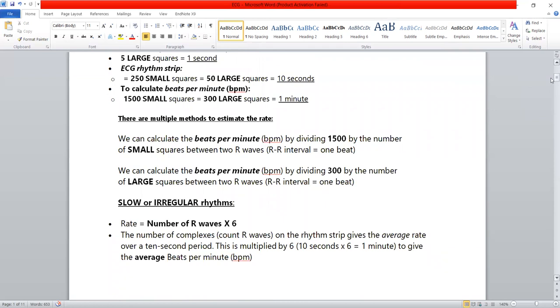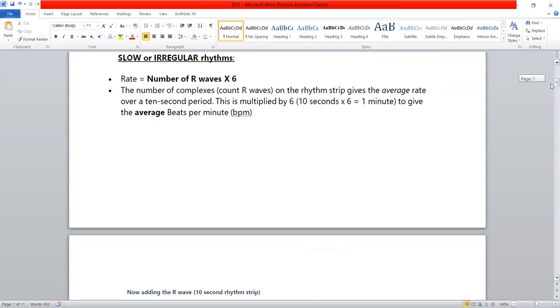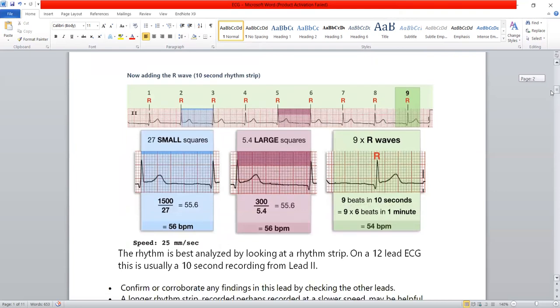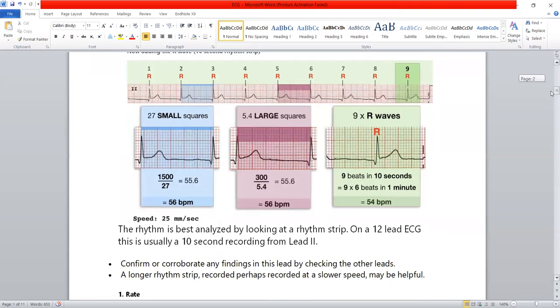The first thing to do when you see an ECG is to calculate the rate. In one big square there are 5 small squares. Look at this diagram — you can see the bold lines marking the boundaries of large squares.